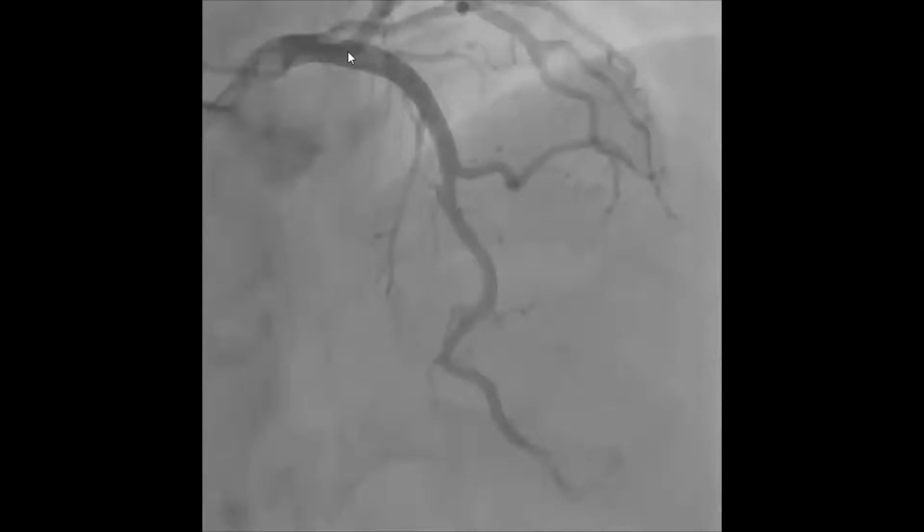And what you're seeing here, the vessel that is occupying most of the screen, this is the LAD. The one that was earlier foreshortened and not quite visible, now it's visible here. Now, in the LAD, on all the cranial views, the branches of the LAD that come off this side of the LAD, going to this side of the screen, these are called diagonal branches.